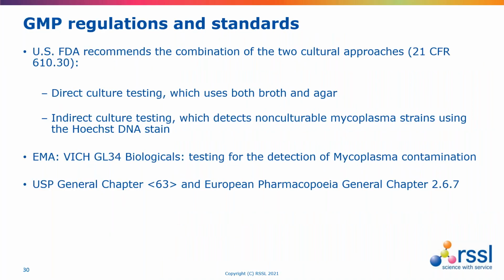We should also be mindful of the regulations referring to Mycoplasmas. So for those working in regulated industries, there are references in the FDA where the cultural approaches are mentioned, which are in CFRs. There's a European Medicines Agency guide, which I mentioned earlier when we looked at the control strains. And there are two pharmacopoeia chapters, United States Pharmacopoeia and European Pharmacopoeia, that direct quite heavily to the culture-based method.